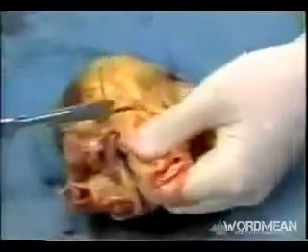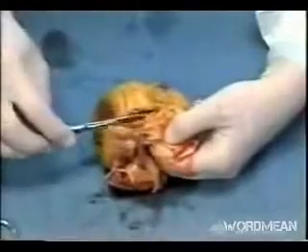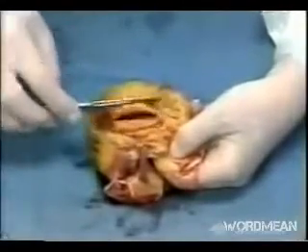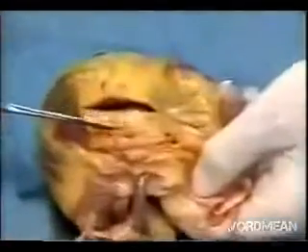Dr. Fricke's now examining the heart. The first thing she'll be doing is looking at the coronary arteries to make sure that they're intact and that there's no signs of thrombosis or atherosclerosis. The artery she's dissecting right now is called the left anterior descending artery, which is the vessel that supplies the anterior portion of the left side of the heart, or the main pumping chamber of the heart.